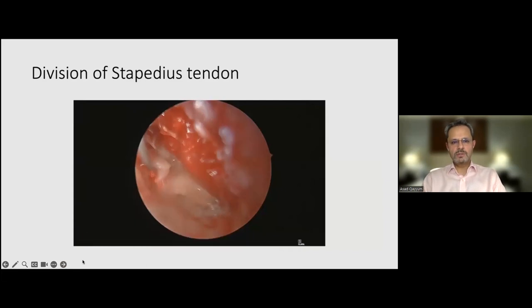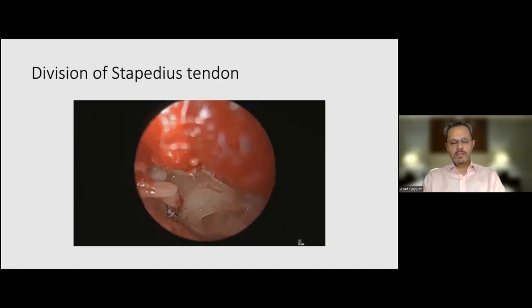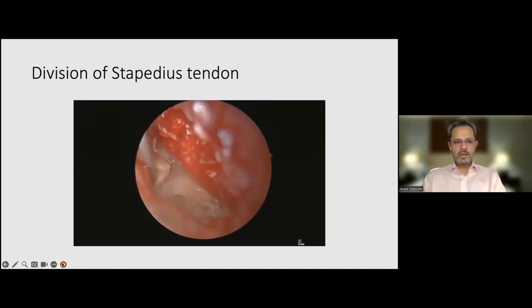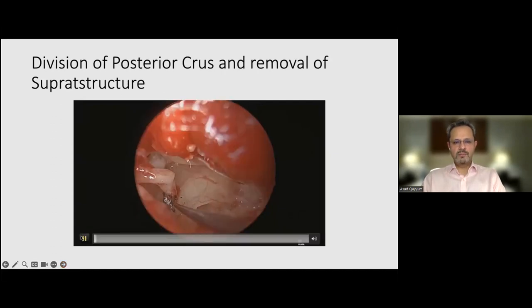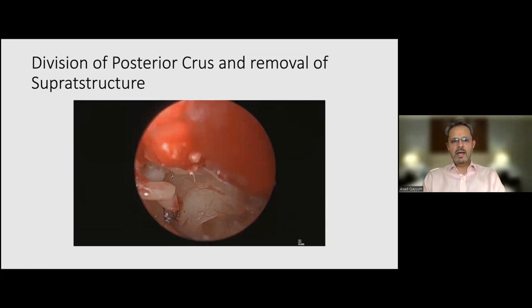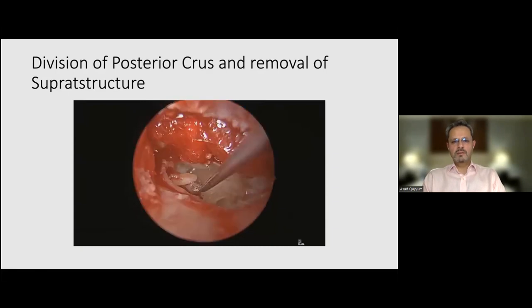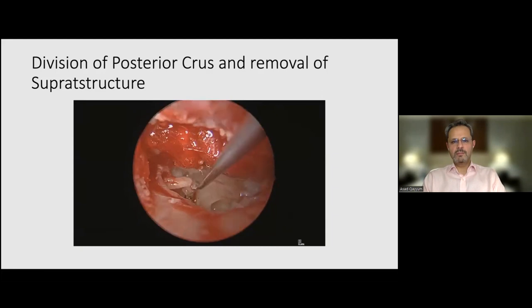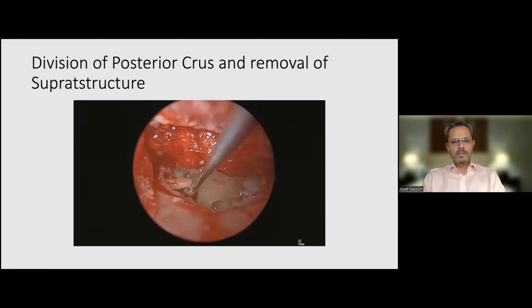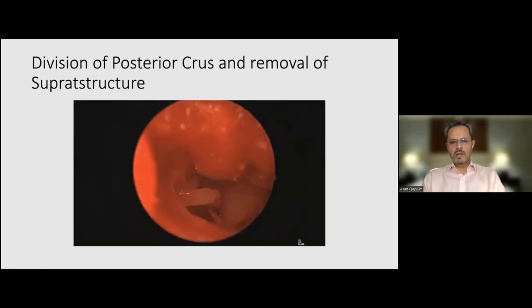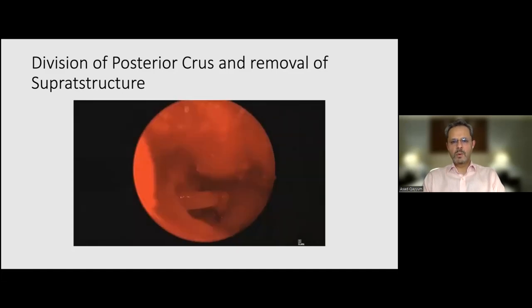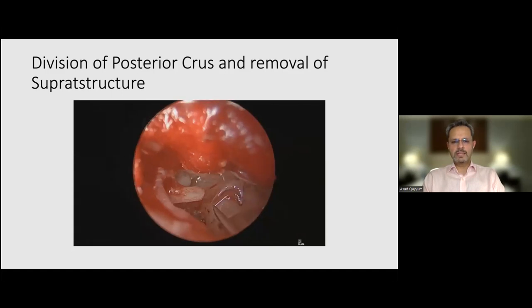I also use a laser to divide the stapedius tendon. Once divided, I can carefully see the posterior crus, then use the laser to further divide it. I then remove the posterior crus with a needle after dividing the incudostapedial joint, making sure I'm outside the capsule. I do not laser the anterior crus — a gentle push toward the promontory allows the suprastructure to fracture away and come out in total and be completely and safely removed.